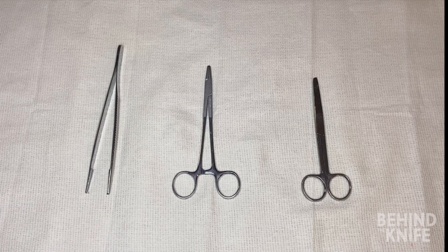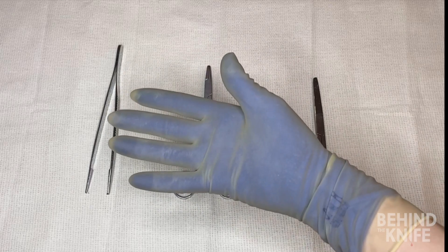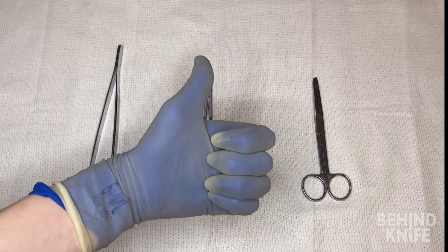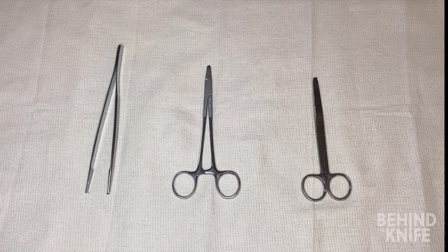The hand I'm going to use to demonstrate these skills is my right hand, so this is for right-hand dominant individuals. I personally am left-handed, but I've learned to use these instruments both ways. We'll have another video demonstrating how to use these instruments for left-hand dominant individuals.